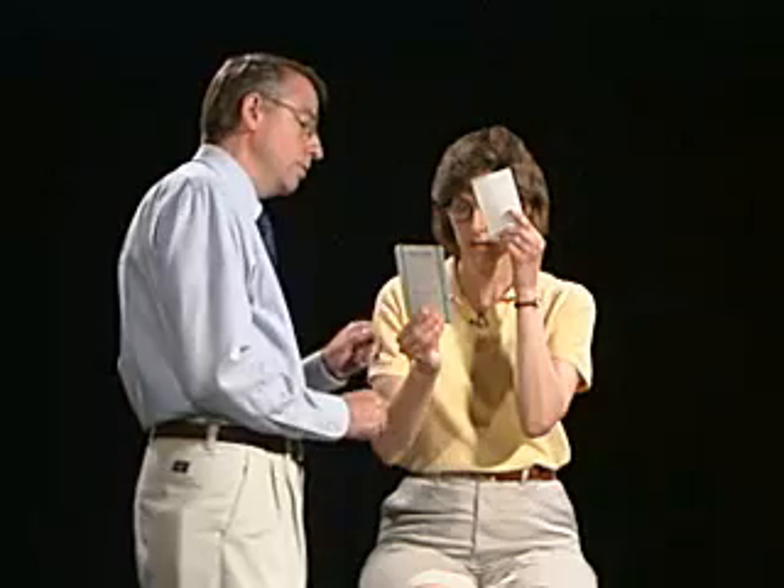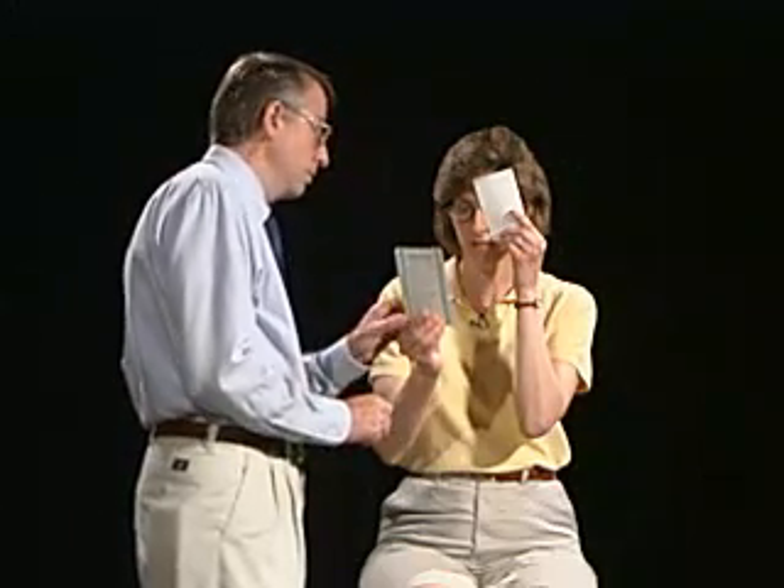Now go ahead and switch eyes. You're going to hold the card — which line can you read? The smallest one again. Okay, go ahead and read those numbers. Four, two, eight, seven, three, nine. Very good.